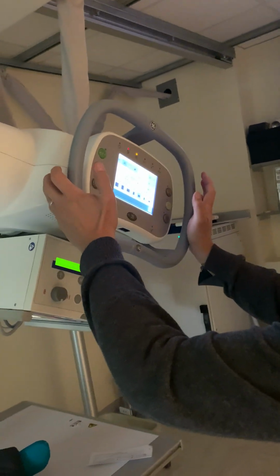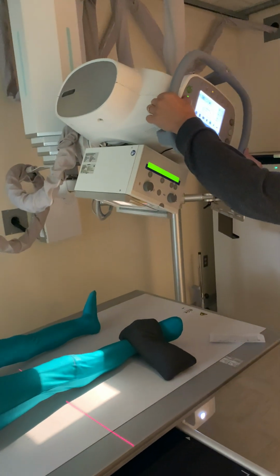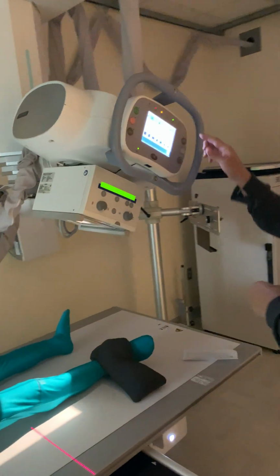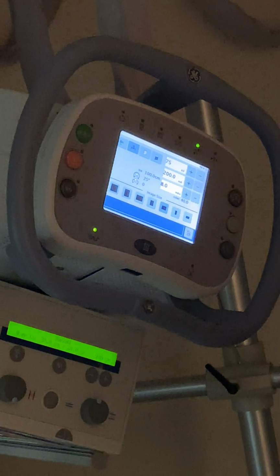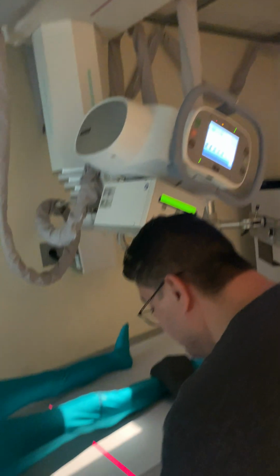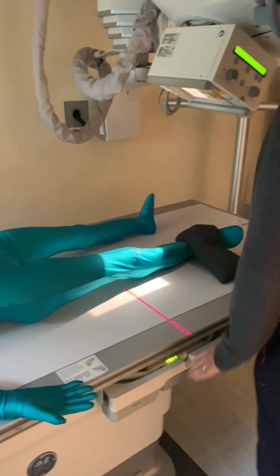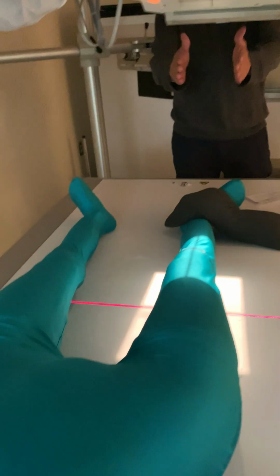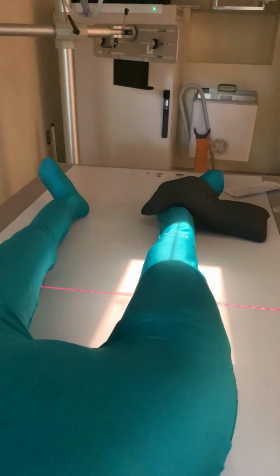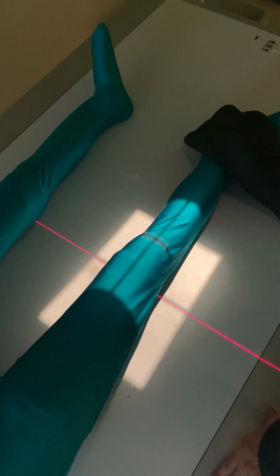I activate the lateral detent, and I slowly bring the X-ray tube until it stops by itself. I verify my lateral detent indicator and it's green. Now I'm okay to close my detector tray. Next thing to do is to make sure that I'm in the center of the lamp, and once I'm there, I want to make sure that I'm at the right level, which is right there.